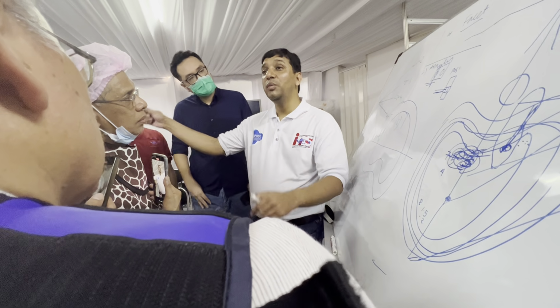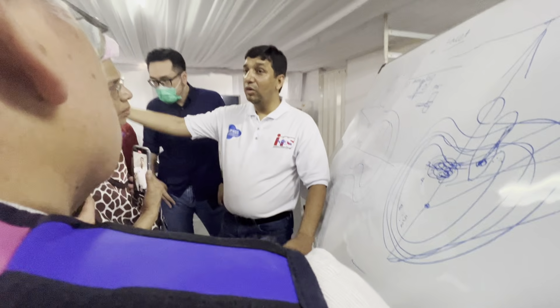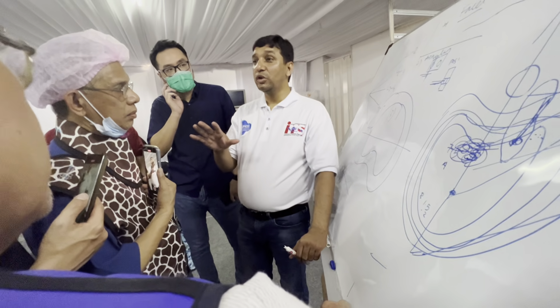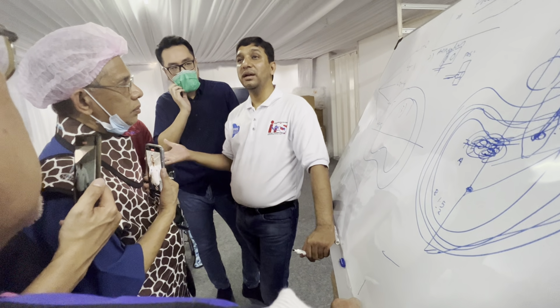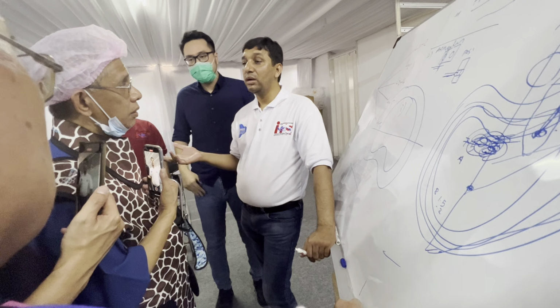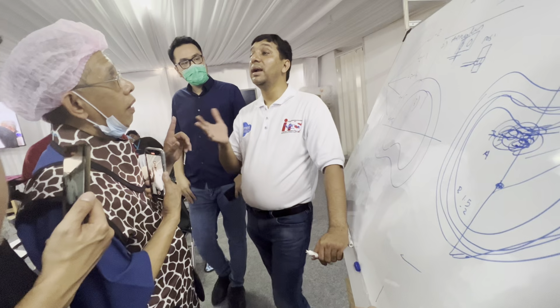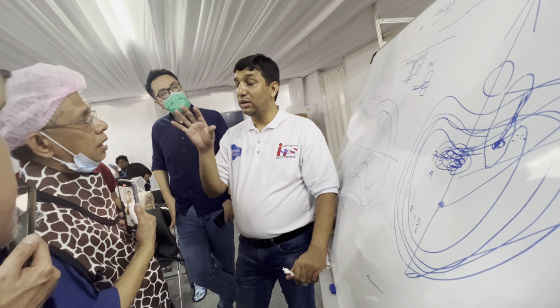Then I don't have to do the opposite side injection. One disc injection will take care of the disc and this side and this side also. So once you use the local anesthetic, you know that both of the sides, do you need to repeat it again or not? You do it at the end or no, as a procedure?